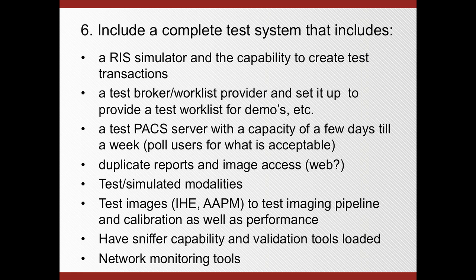You also want to have test modalities and simulated modalities, and it could be as simple as having a computer somewhere with a DICOM send capability, so you can simulate sending images. For example, if you get a new modality coming in, you might want to call the manufacturer and say, give me a CD of these new images, put it on the test simulator, and you can test your system.